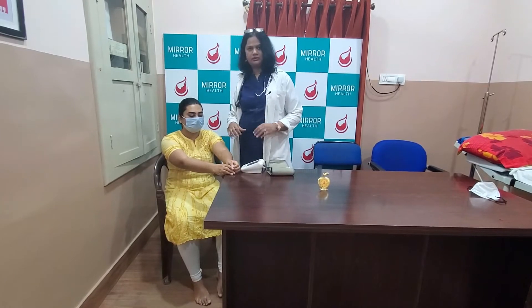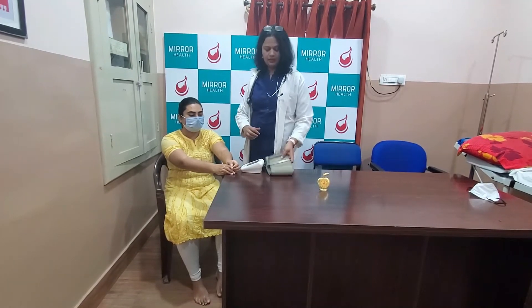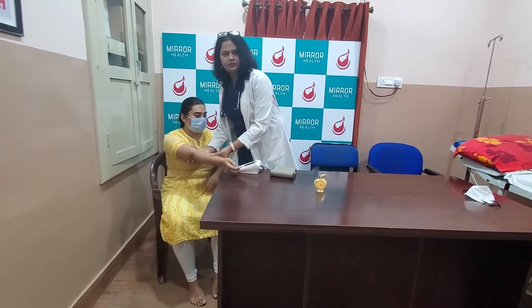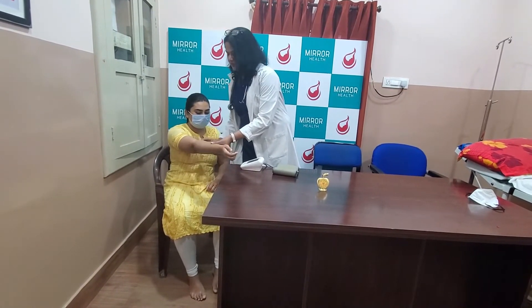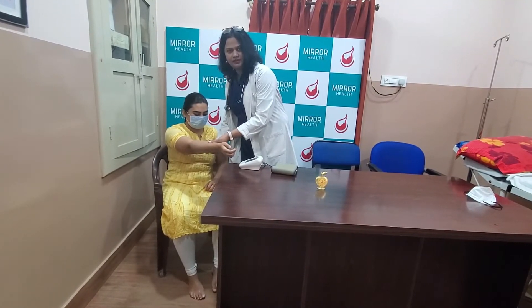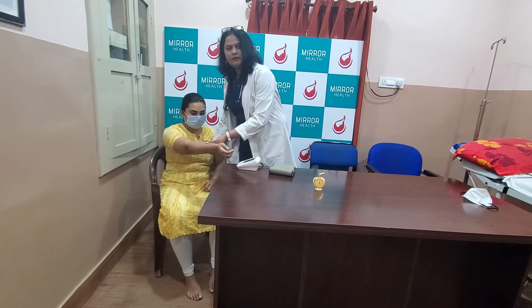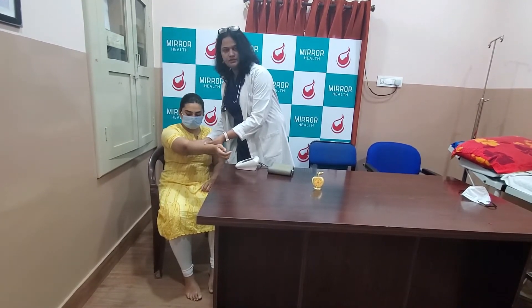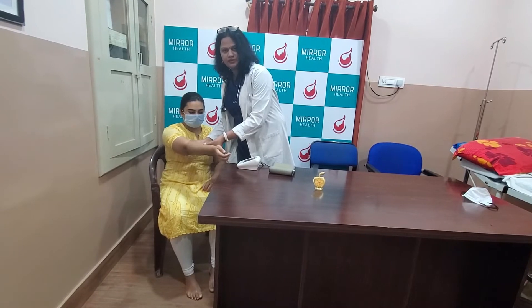You can see that the feet are on the ground and she is comfortably placed. Now I am going to assess her. I am going to pick up the right arm, as most of the recommendations say, and I am going to palpate her brachial artery. I am also making sure that I identify a point which is about 2.5cm from the antecubital fossa.